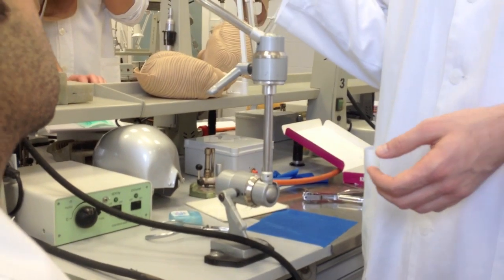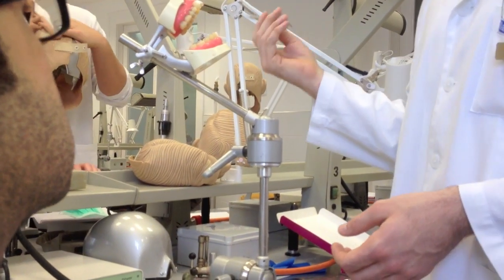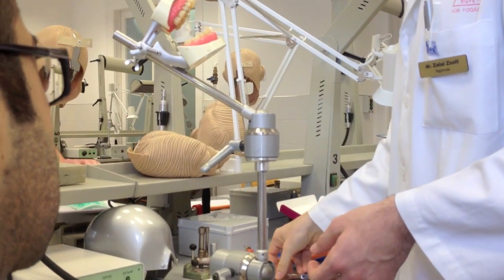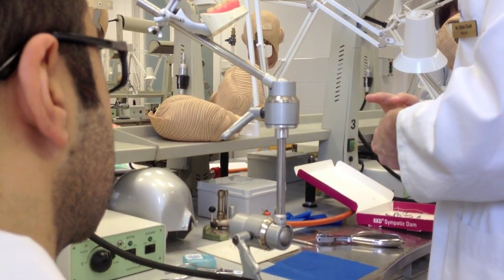This is a kind of instrument which is not sharp. It can be a Heidemann, it can be a ball burnisher, it can be anything, because the sharp parts can appear over.